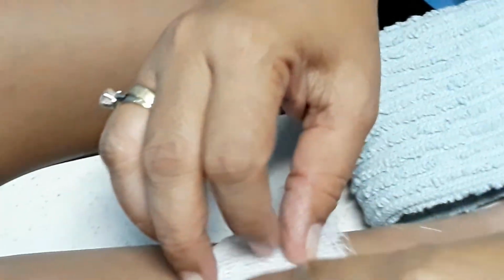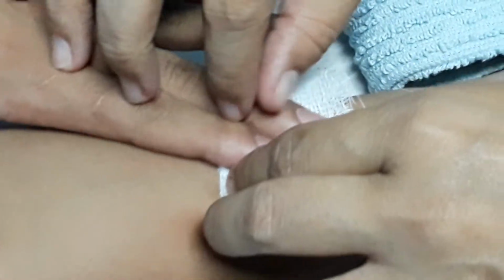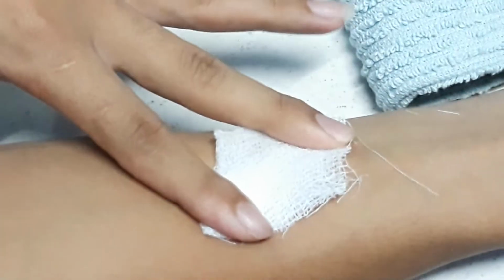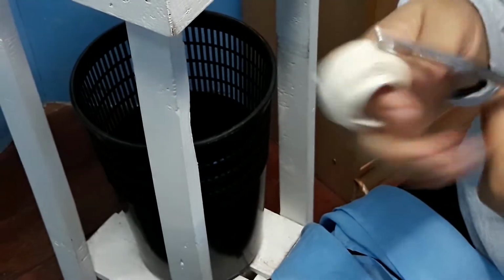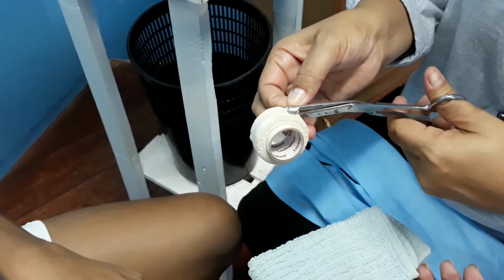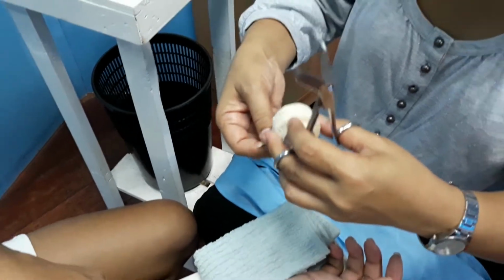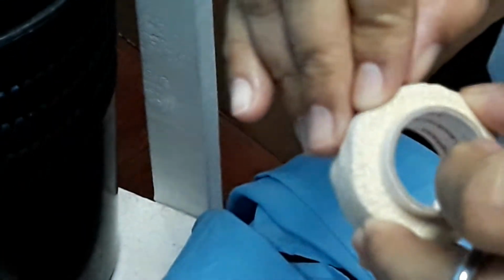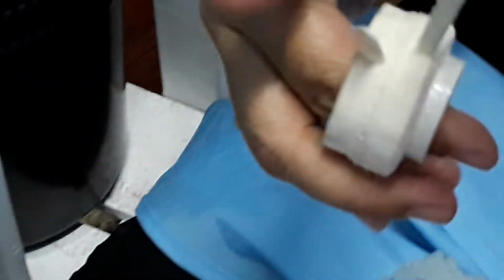Okay, like that. Then after which, you ask your patient, "Ma'am, you may hold now your gauze." Make sure that the patient will hold it like that. And then after that, you may start offering your plaster. You may assemble your plaster beforehand, or you may assemble it after you are applying your OS. Okay, this is so thin. Okay, like that. Sorry for the plaster because the plaster is so thin.